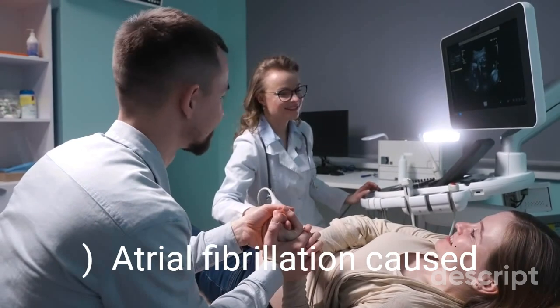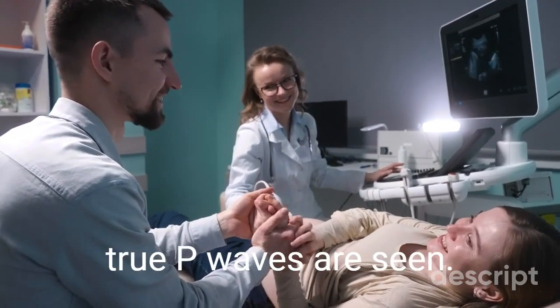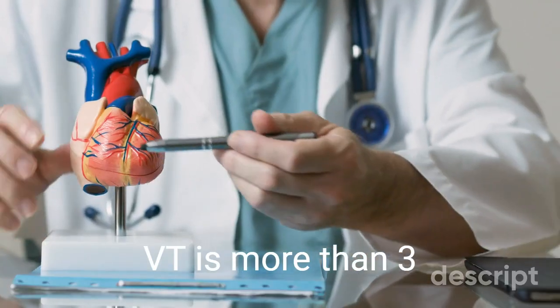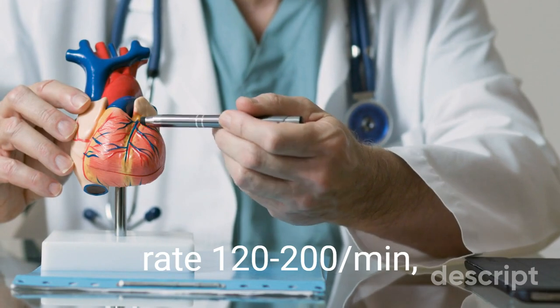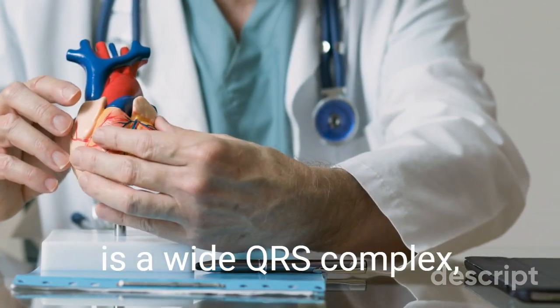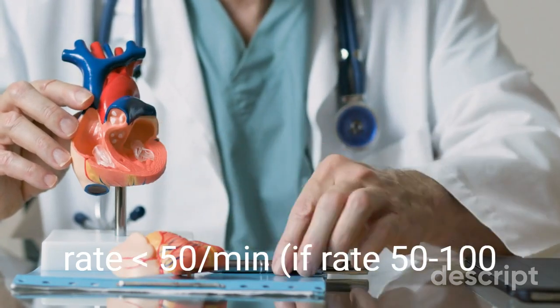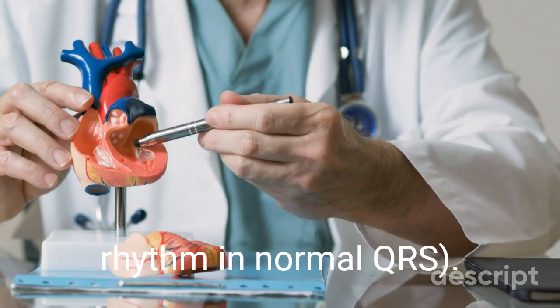Atrial fibrillation is caused by multiple reentrant circuits, has a baseline of fibrillation waves, and no true P waves are seen. VT is more than 3 consecutive PVCs, rate 120-200 per min, slightly irregular. Idioventricular rhythm is a wide QRS complex, rate lesser than 50 per min; if rate 50-100, it is called accelerated idioventricular rhythm. No leading P wave.